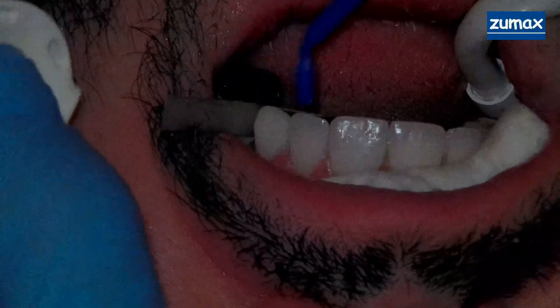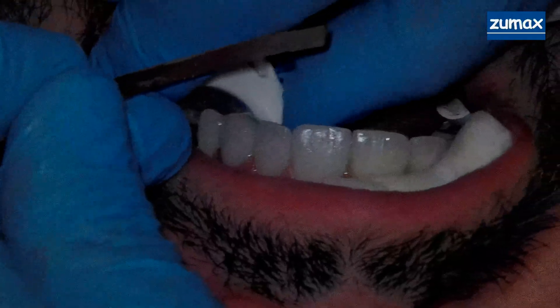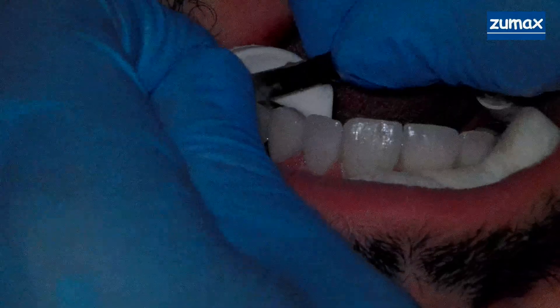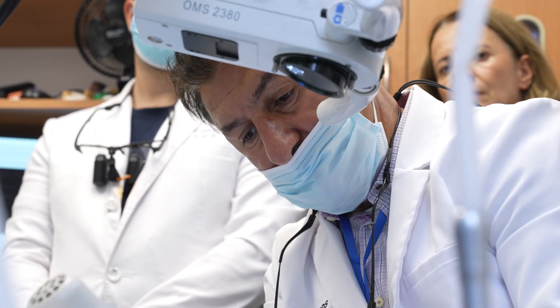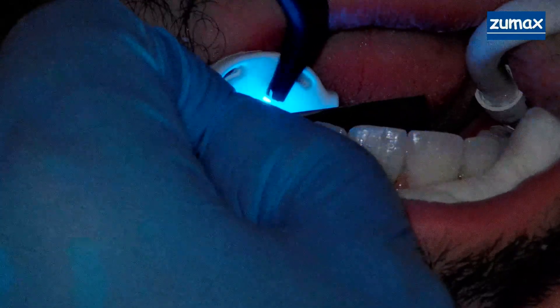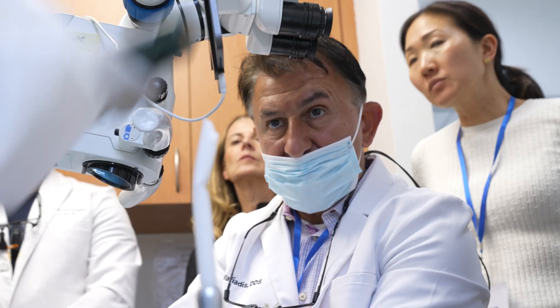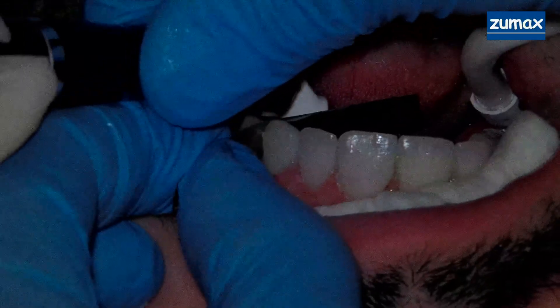Let me wipe that down. Take that out for a second. So I got that in. I put back the other one. Now I got my premolars — the premolars have a larger contact, so you really got to leave it there. Give me a full cure on this one. I'm worried about the premolars because the tooth is larger than just the veneer — we have an onlay veneer. So I want to really tack that one down and lock it in.